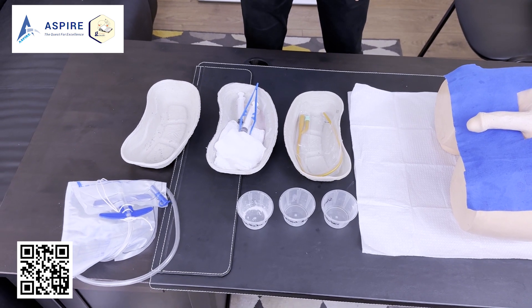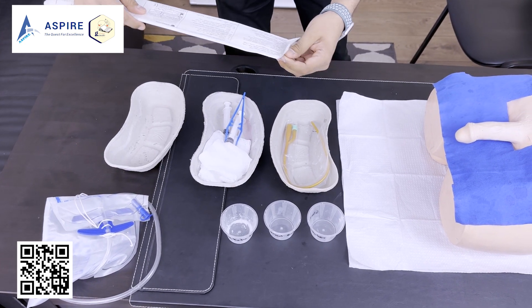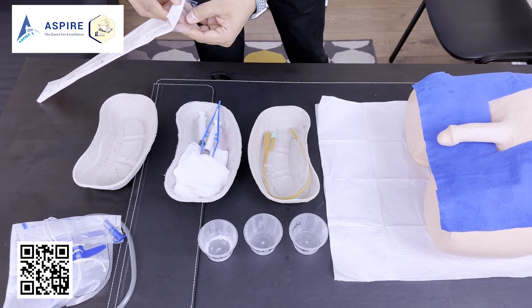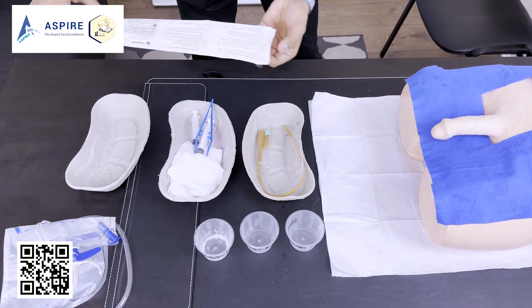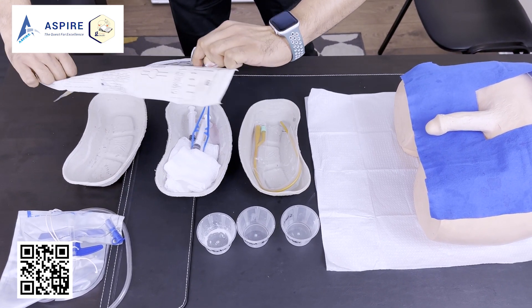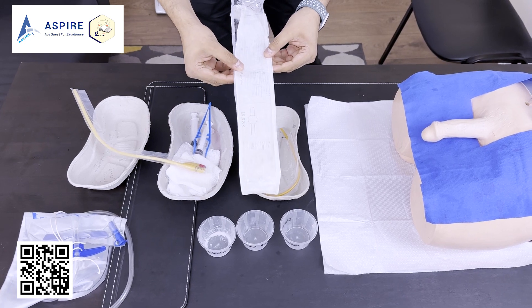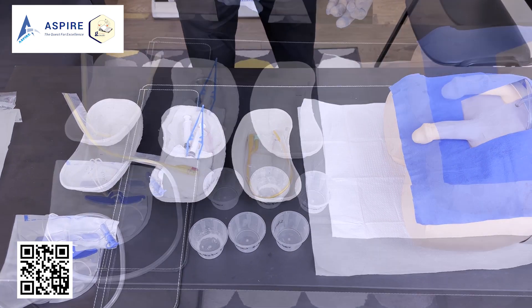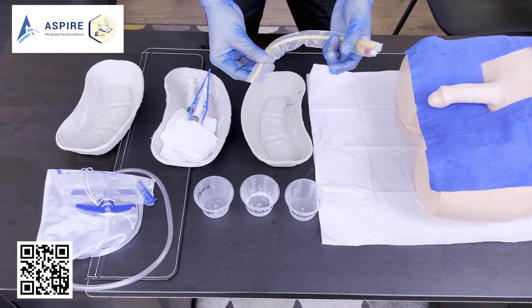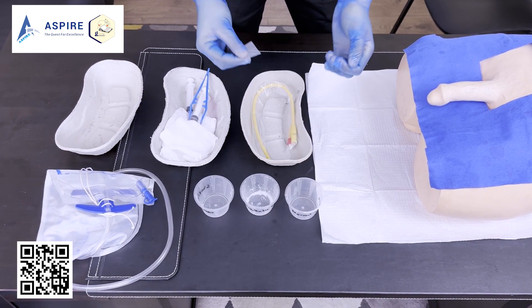If you are getting a new catheter, open it using a non-touch technique, because this is a sterile station. The outer covering is not sterile, but the catheter inside is sterile. It's better to have a staff member open it for you, or open it carefully without touching the catheter inside so it drops into the kidney dish. Before you start, take the covering off the catheter and it's ready to use.